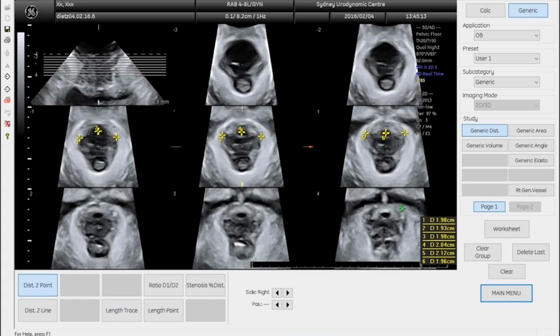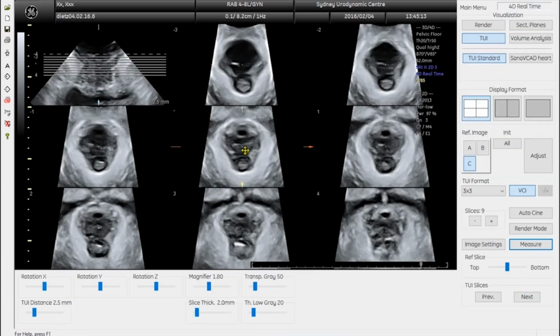Another issue, something else to point out, is the appearances in the coronal plane, and for that we go a little bit higher here. What you see here is a reference plane in the coronal plane, and there's a lot of muscle here and there, and it's quite symmetrical. You can see that this inverted funnel of the pelvic floor muscle opens up further, and that the muscle gets a lot thinner here in this area, which is the iliococcygeus.